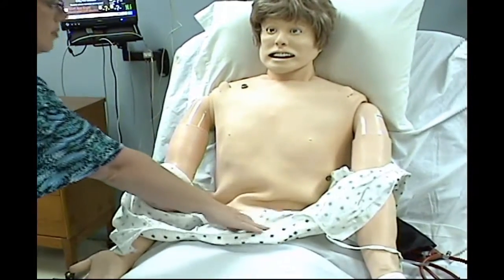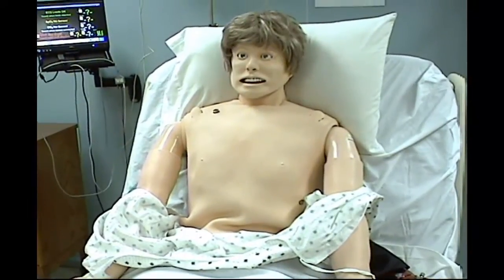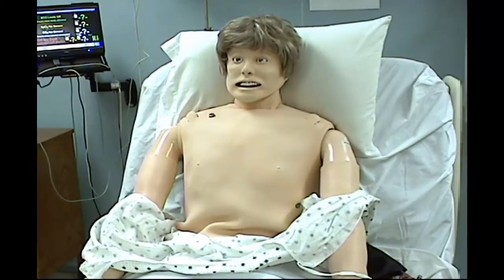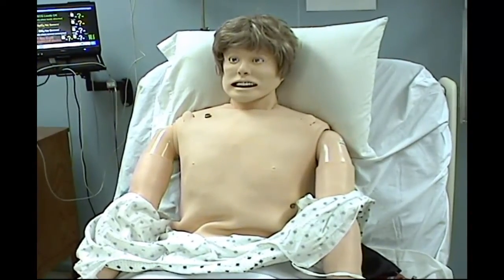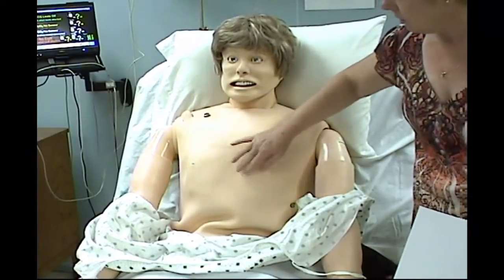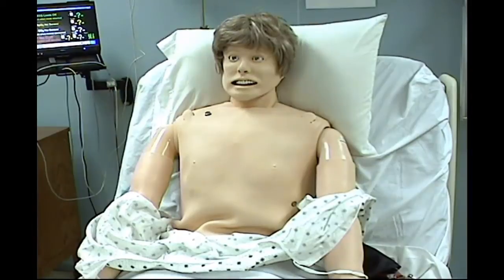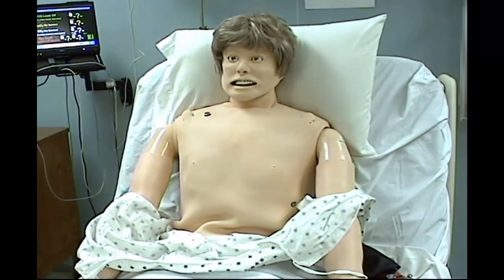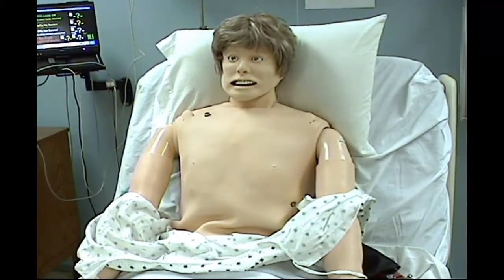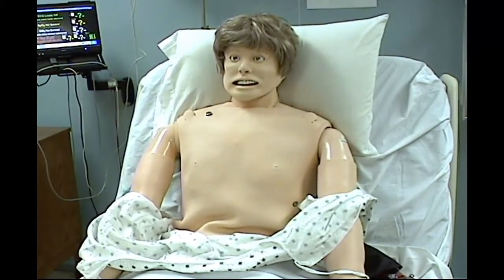You may auscultate heart sounds anterior, and lung sounds may be auscultated both anterior and posterior in upper and lower fields as well as lateral. So you can hear upper, lower, and lateral. During auscultation, the rise and fall of the chest wall will stop momentarily to allow for assessment of heart and lung sounds. When the chest is not rising or falling, you will not be able to palpate peripheral pulses.